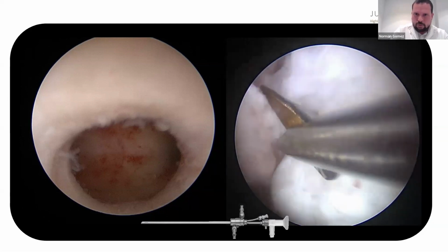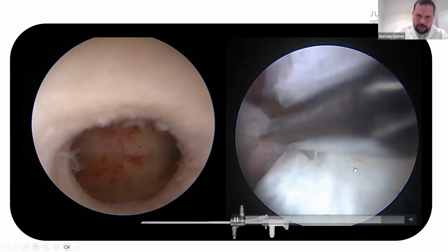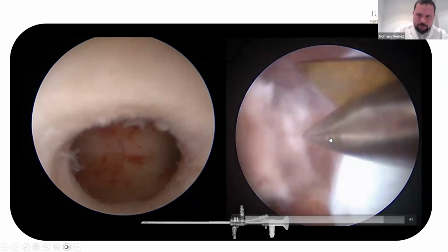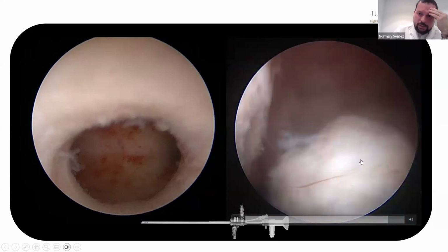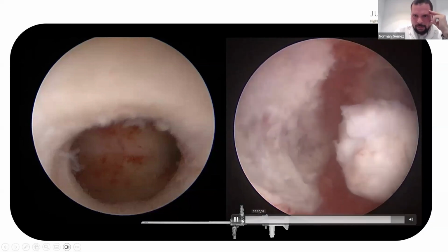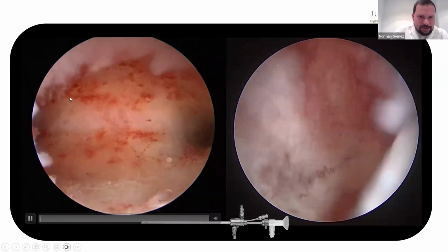You can see here it's almost done, the surgery. The final fibers we are cutting there. And that's it. And we preserve all the pseudocapsular plane. This is another case. This can help you.